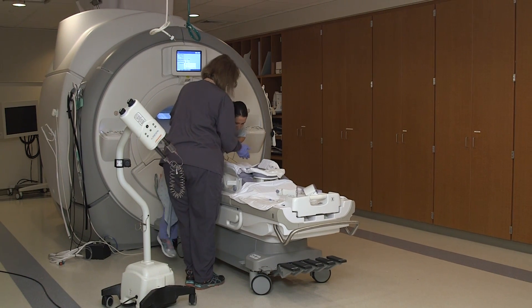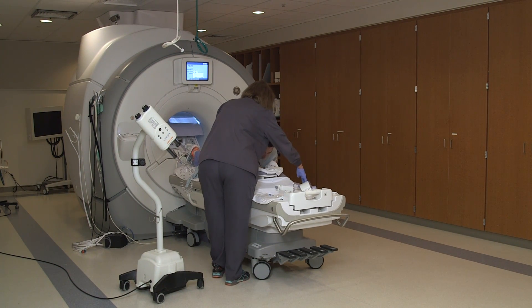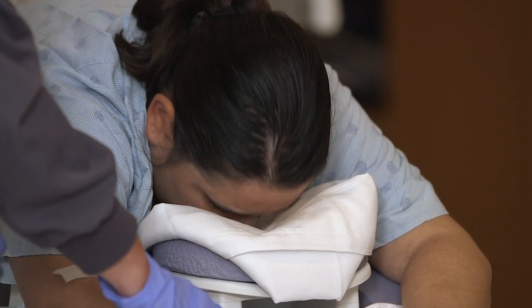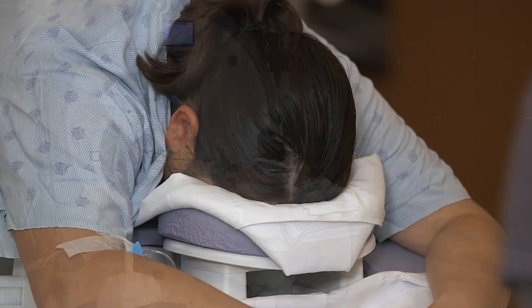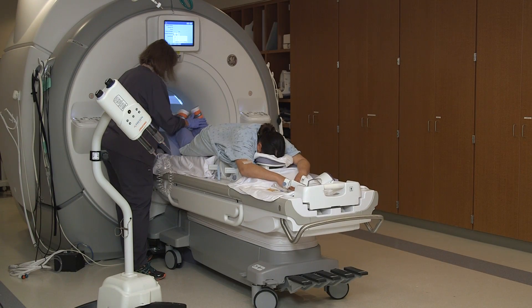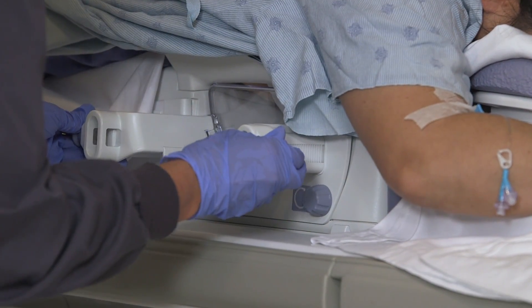During the test, you will lie in a prone position on a padded table. This means you will be face down and on your stomach. The table has a hole cut out for your face with a padded rest for your forehead. This allows you to breathe comfortably while in this position. Your breast will fall freely during this scan.